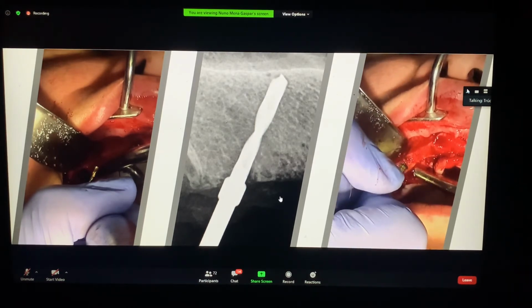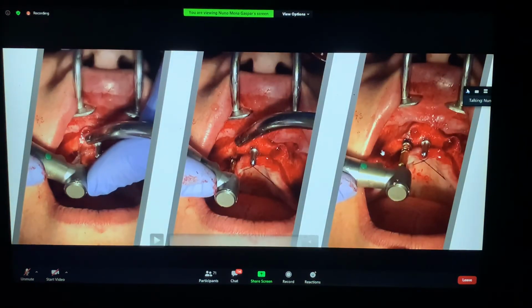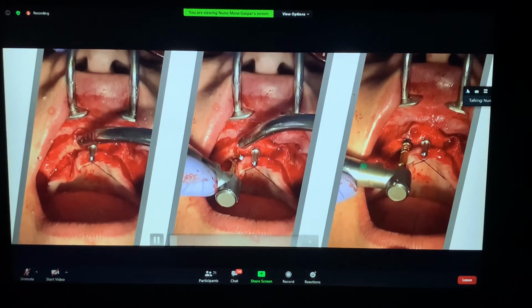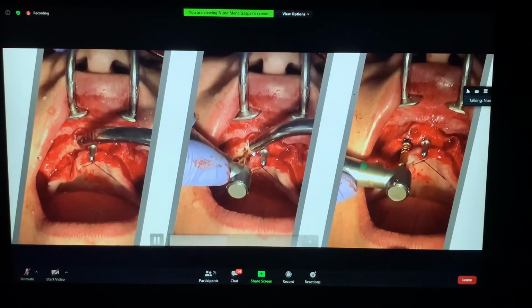Và ở đây tôi dùng con 4 5. I want to ask about the size of the implant. This is 4 by 15. Và con này tôi cắm là 4-15 và nghiêng 30 độ. So on the anterior, you have harder bone. So here, you can do more drilling than on the back.